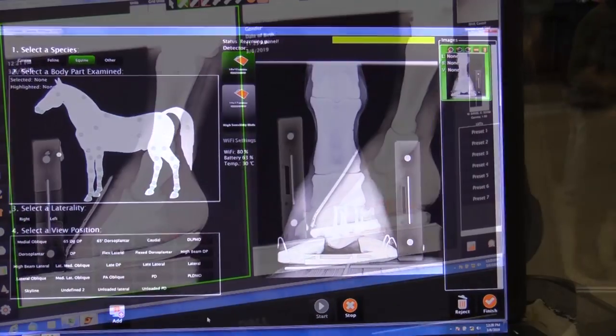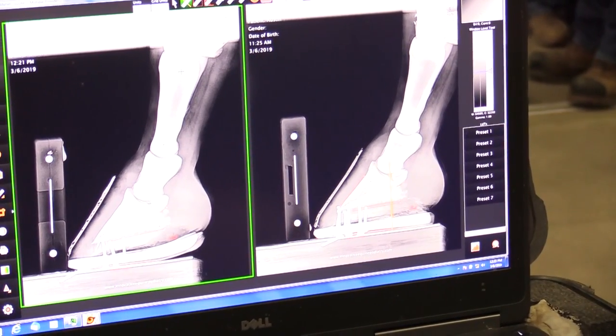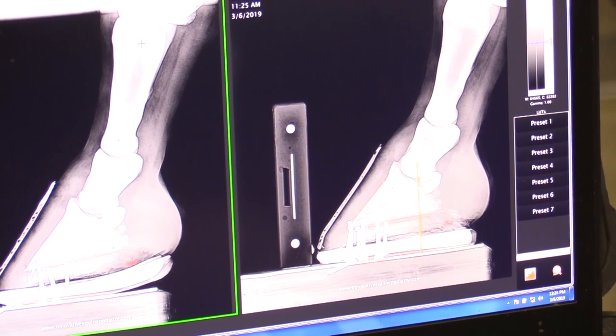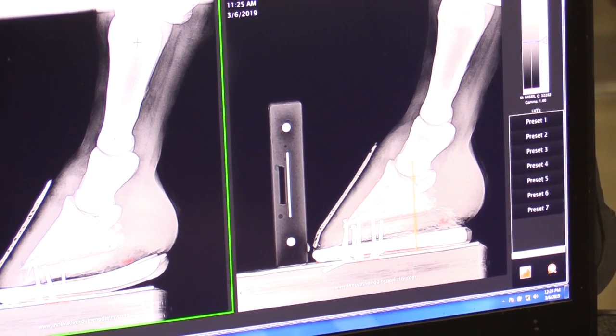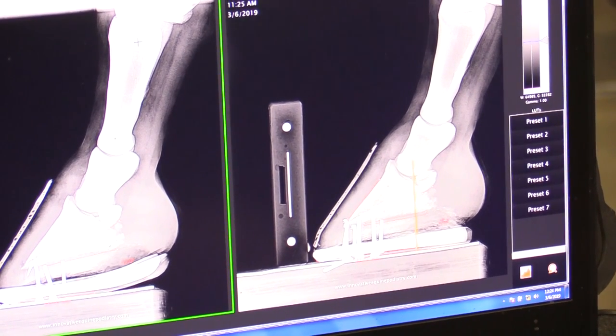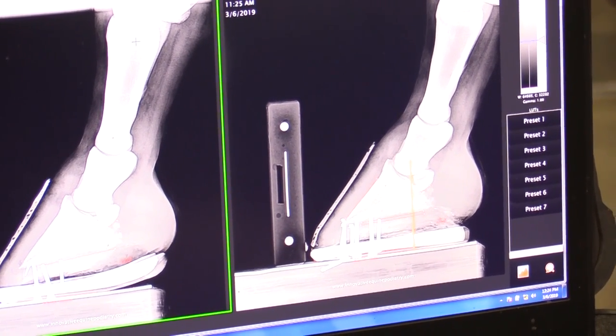Bringing up the panel. So I just made some quick measurements here. So the palmar angle change, I'll show it to you when you pull it up. We had a 2.4 degree palmar angle, and now we're up to a 6.1. So we increased the PA by the trim and mechanics of the shoe.